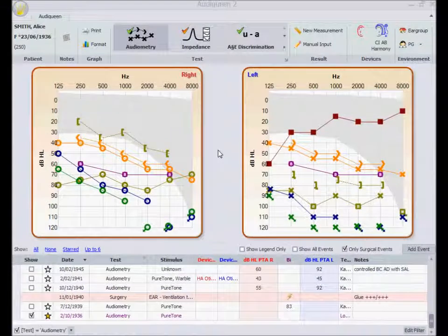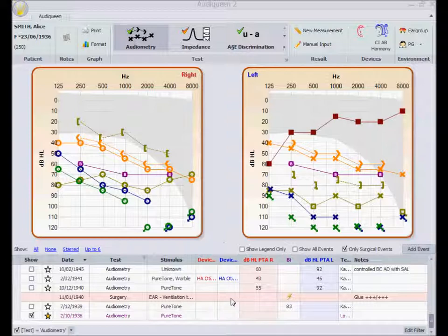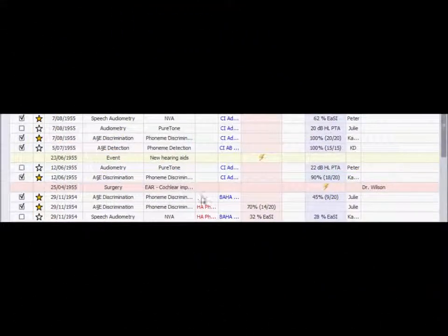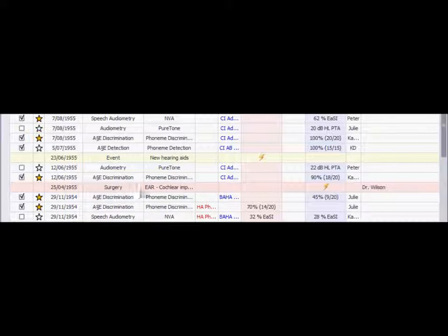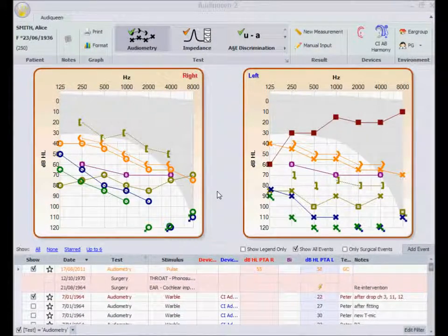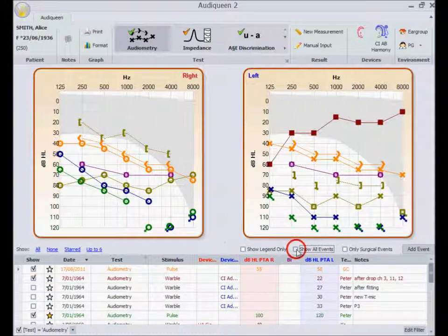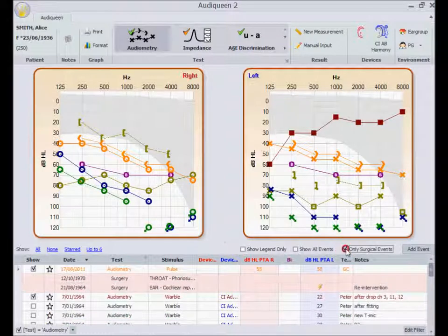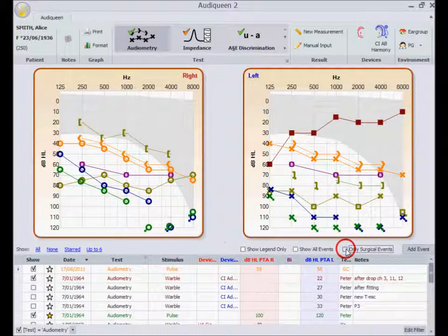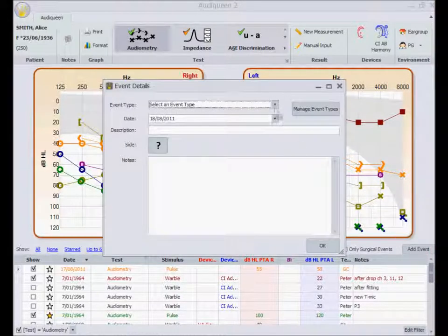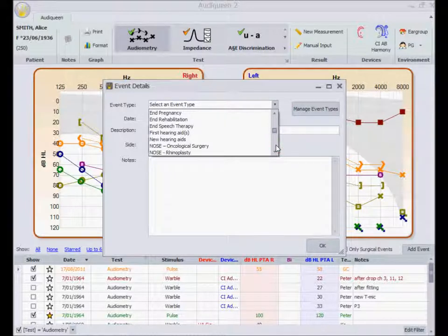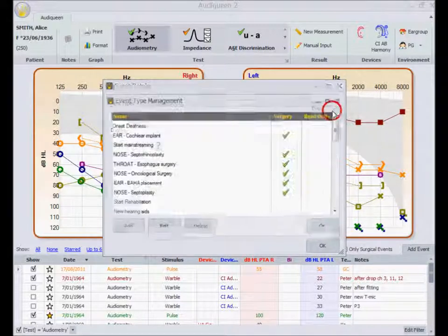One other feature is the possibility to add events. Sometimes this is interesting as a kind of reference point in the chronology of the test results. Such events can be either surgical interventions or other events. Events can be displayed or not, or I can choose to display the surgical interventions only. I can add events and create new event types if need be.